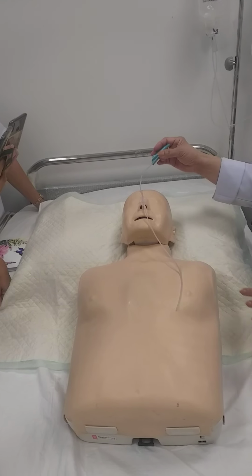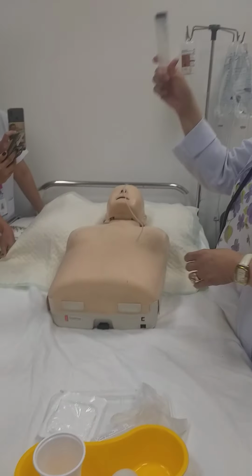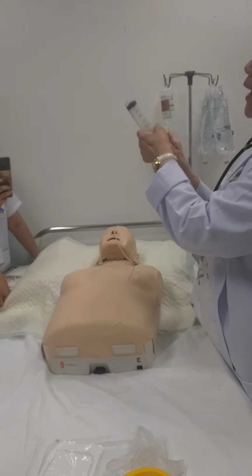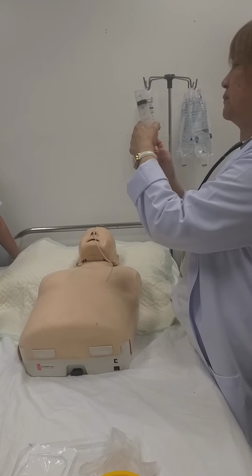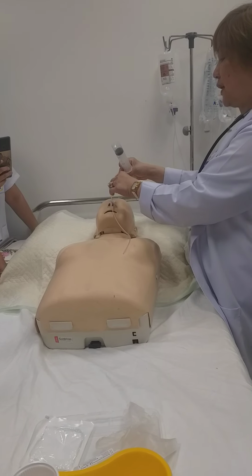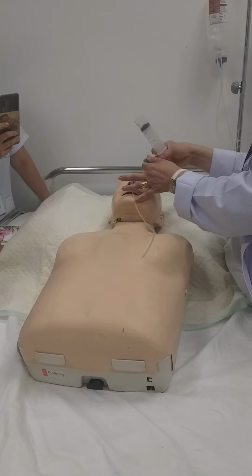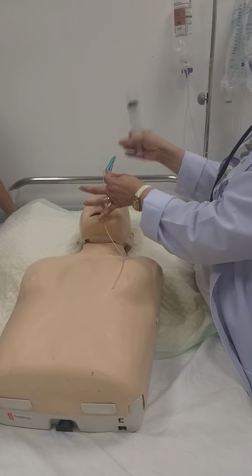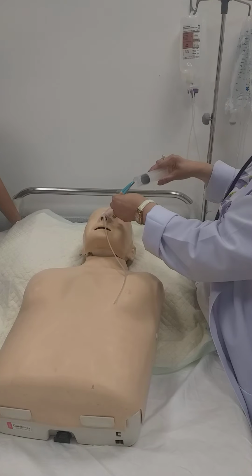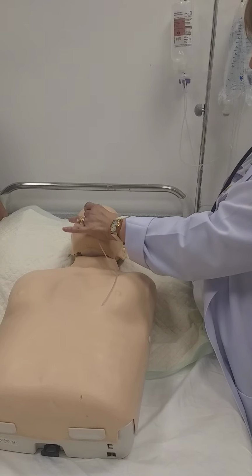Okay, now let's do the three tests. We will get our, what is this? Aseptosyringe. So you have to aspirate 20 of air. Okay? Open or pinch. Whenever you open and close, pinch. Like this. Pinch. Okay? Open. There is a cover here, as I told you. So pinch, open, and connect.